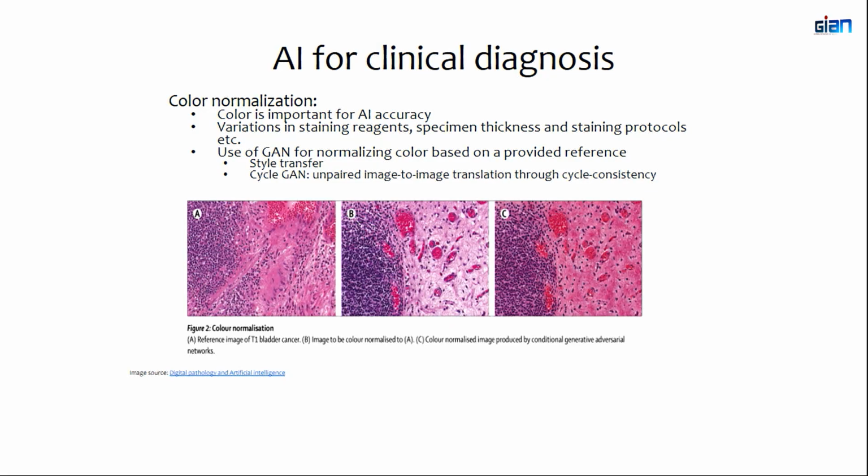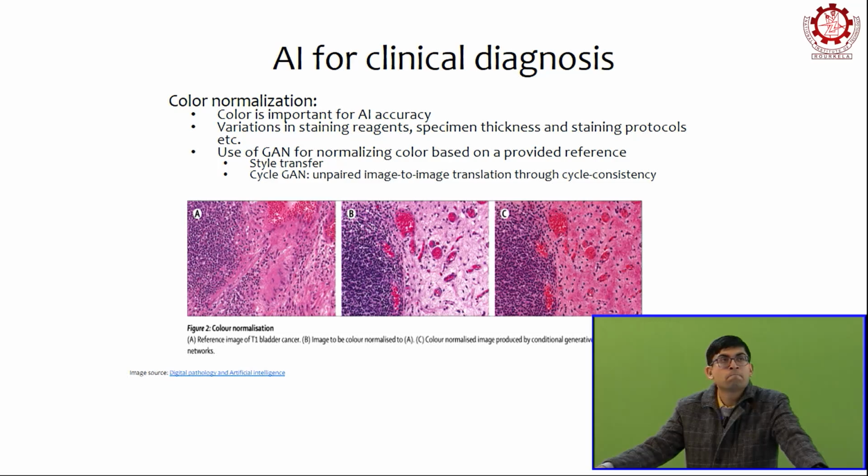So yesterday there were questions regarding site variance, right? If there are images collected from one site, and models trained with images collected on one site, and then you have your test data that is coming from another site, how do you ensure, what are the pre-processing steps that you take to ensure that your model works on images collected from another site? Right. So yesterday we spoke about a few methods for radiology.